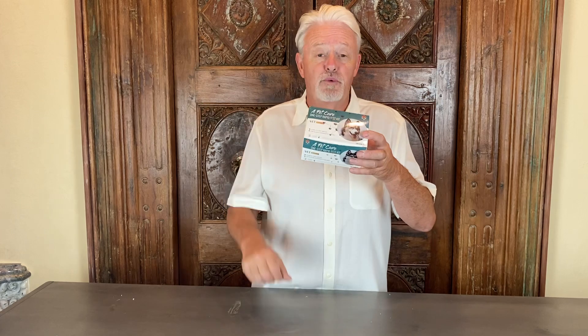Giardia is something I deal with occasionally in puppies, and the test gives me a quick diagnosis so I can treat it properly. And the pregnancy test is a fun one — when that line shows up and you've got a pregnant dog, it's like Christmas is coming! If you have any questions, give us a call and talk to a real human being who knows the product and can answer all your questions.